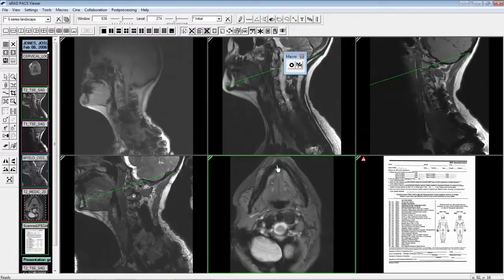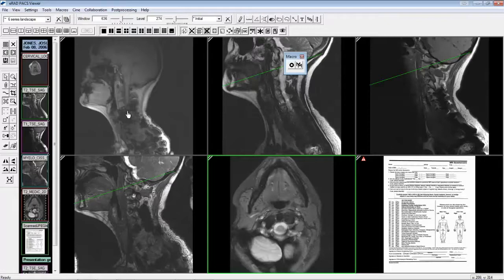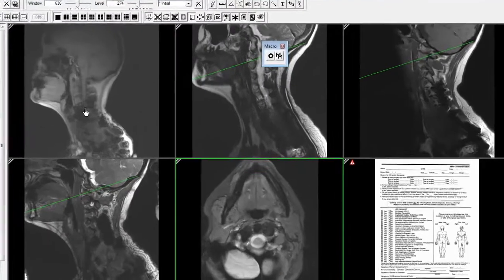To apply a keyboard macro, press the input sequence assigned to the macro. You can also assign the input sequence to an external device such as a Philips speech mic by using the Philips device control center software. Gaming mice and programmable X keys have also been used in this way. Macros are available for reviewing, editing, and deleting from the macro manager icon.